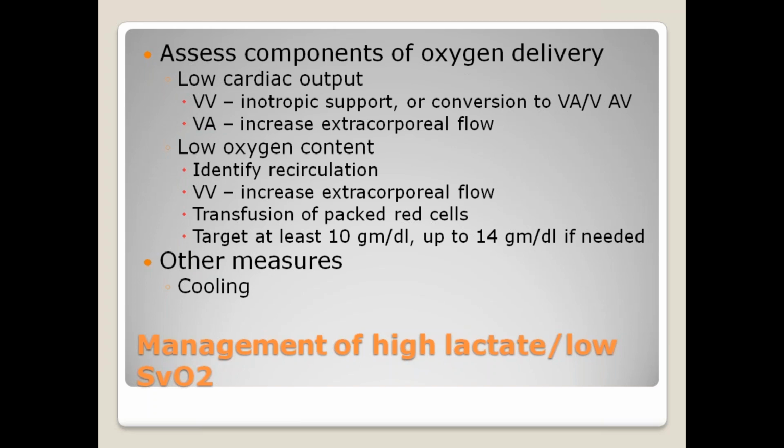That's a simple example of it. A patient of ARDS, you put the patient on ECMO, and then he goes into sepsis and develops septic myocarditis. And because of septic myocarditis, his cardiac output has gone down, and that is leading to poor perfusion. So you can easily think of starting some inotropic support, and if not responding, then you have to switch over from VV to VA. I prefer VAV more. If the patient is on VA mode and the patient goes into RV failure, you have to increase the extracorporeal flow.